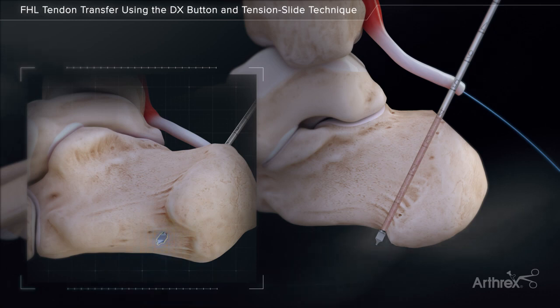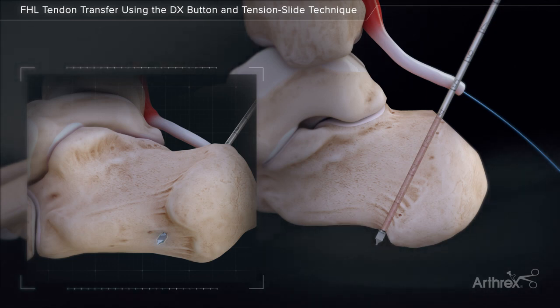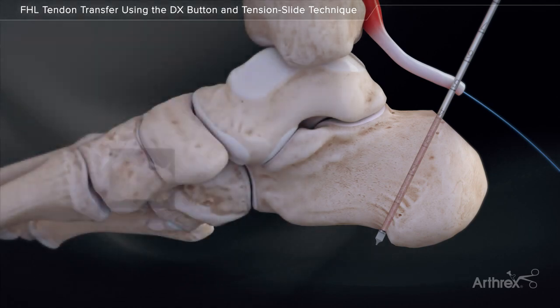bicortical, aiming 1 cm anterior to exit the plantar surface in the midline of the calcaneus and centered medial to lateral. Note, fluoroscopy is recommended to ensure the 3.2 spade tip pin just breaches the plantar cortex. It is important to make sure the drill does not exit along the plantar posterior tuberosity.